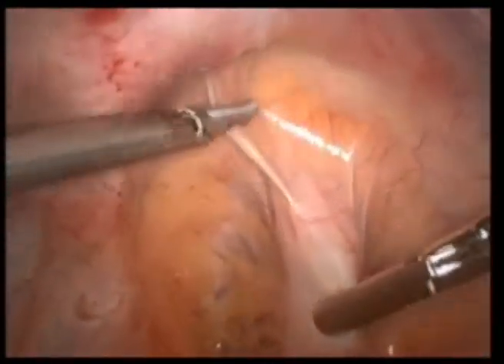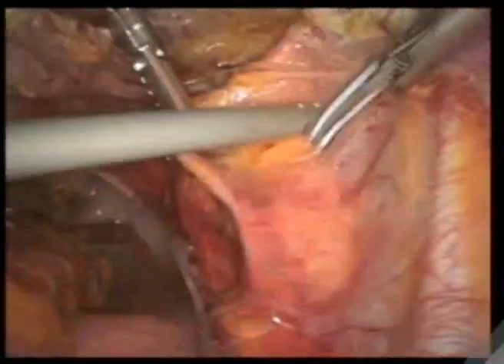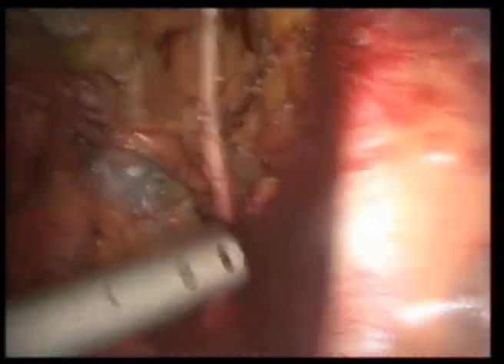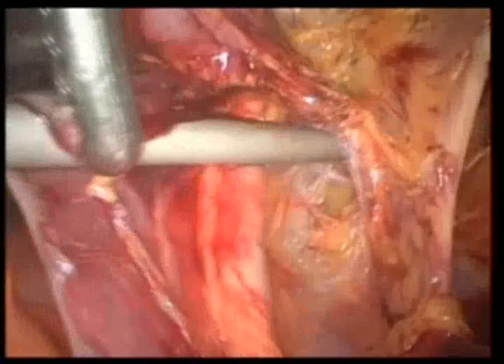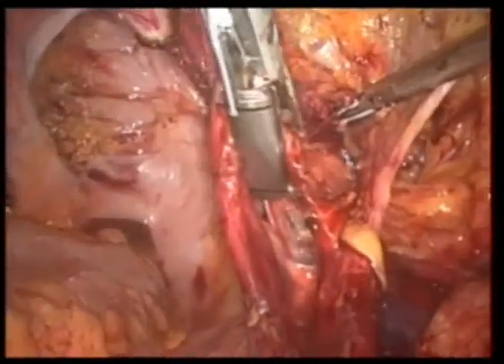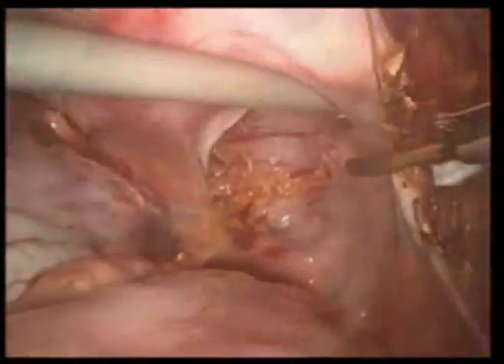To commence the radical hysterectomy, the avascular spaces are developed. The rectovaginal space is opened using blunt and sharp dissection. The anterior cul-de-sac and vesicovaginal space is also subsequently developed. The right superior vesicle artery is identified here. An overview of the right pelvic sidewall shows the external and internal iliac vessels, the right obturator nerve, the right superior vesicle artery, and the avascular spaces — the pararectal space and the paravesicle space. The right uterine artery is identified and transected with the ligature device at the level of the hypogastric. Continued dissection of the parametrium is performed to the level of the rectovaginal space that was developed previously.